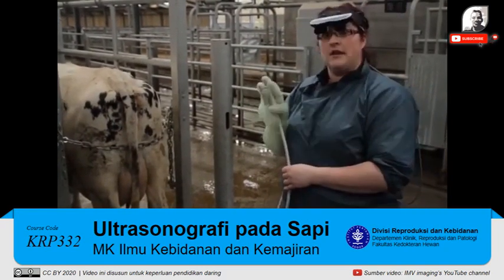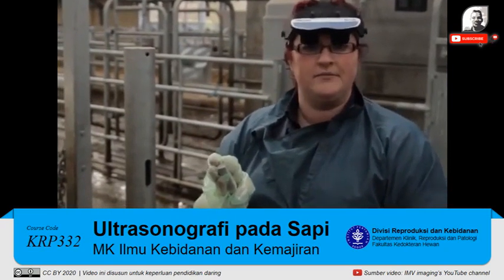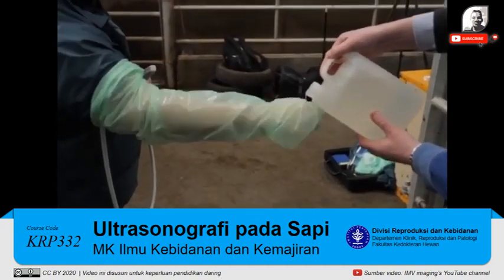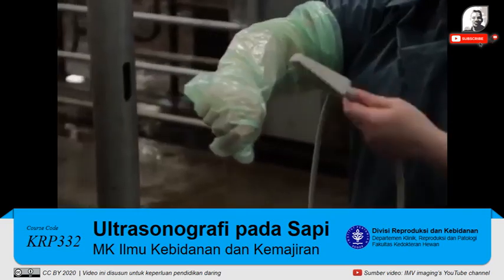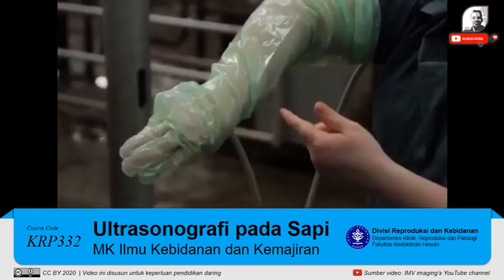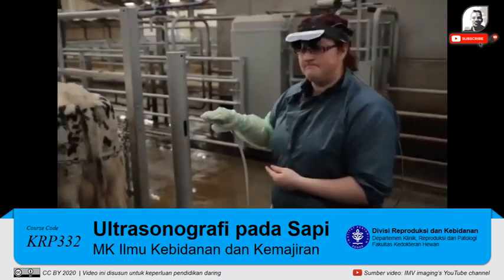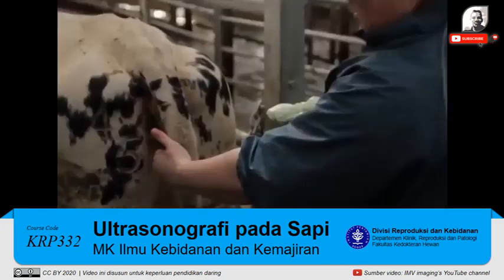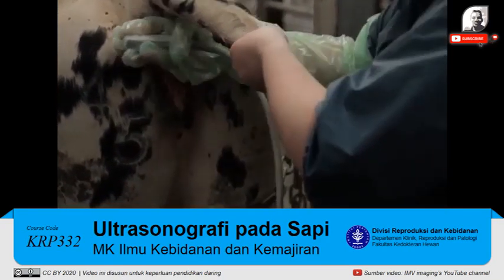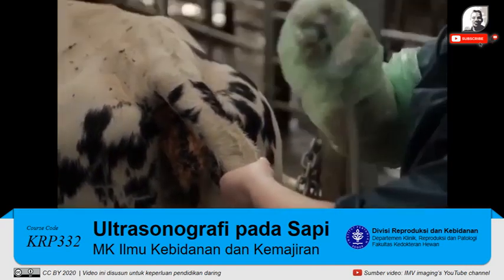Now we're ready to go inside the cow using gentle handling techniques, just as you would with manual palpation. We get some ultrasound lube, putting it both in the palm and on the back of the hand. We cover the surface of the probe and use what's on the back of our hand to lubricate the cow. Gently grasp the tail, use the back of your hand, and close your fingers around the end of the probe.